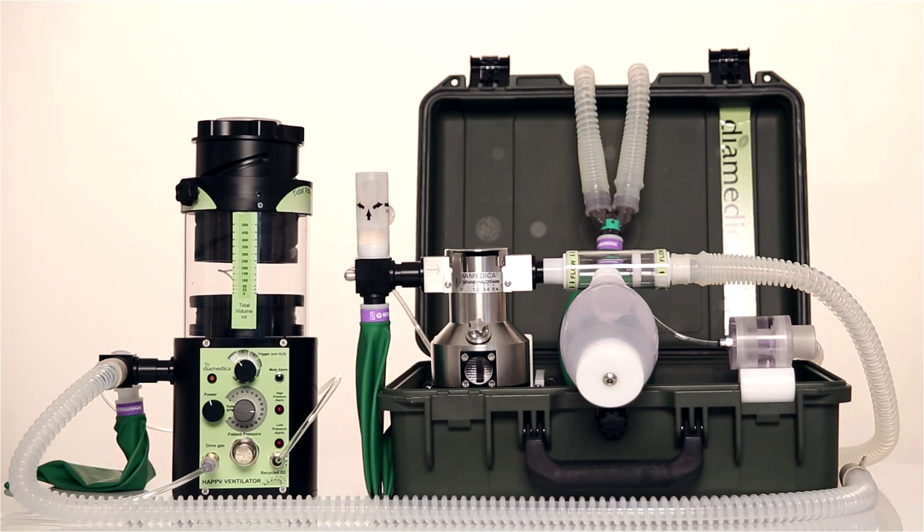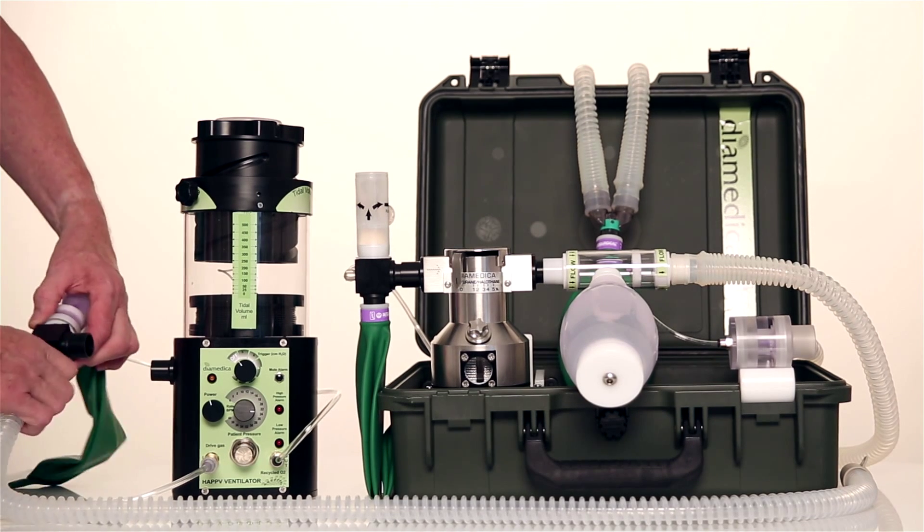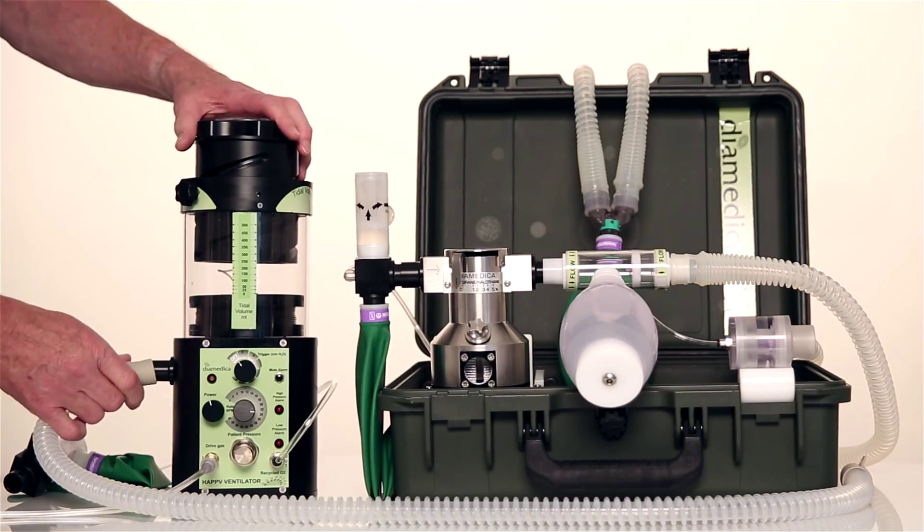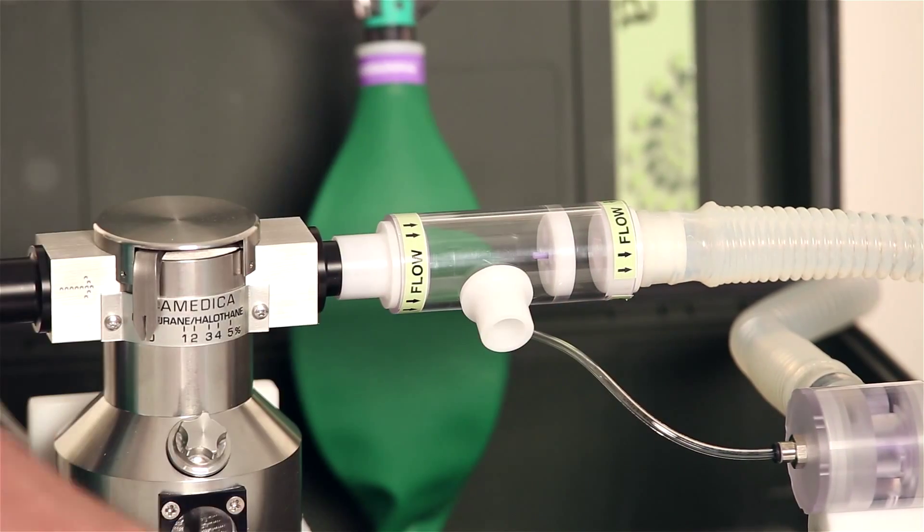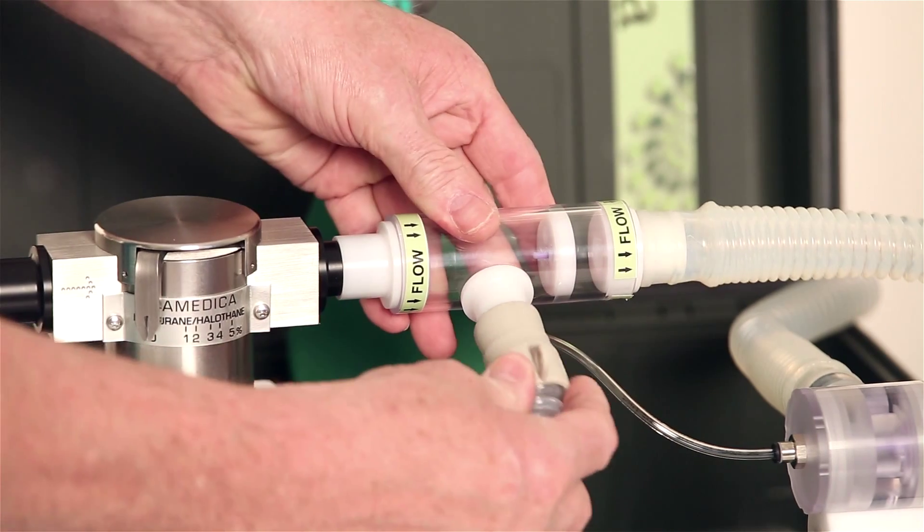If the helix is used with the DPA-02 anesthetic machine, then the circuit block is removed and the ventilator outlet is simply connected to the DPA-inspiratory valve in place of the self-inflating bag.